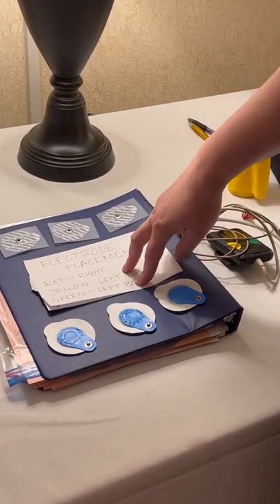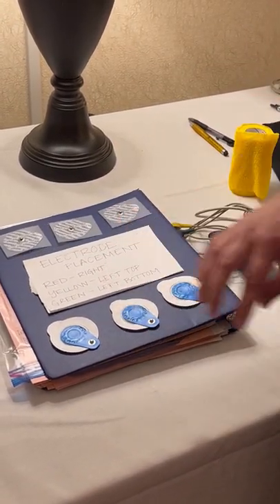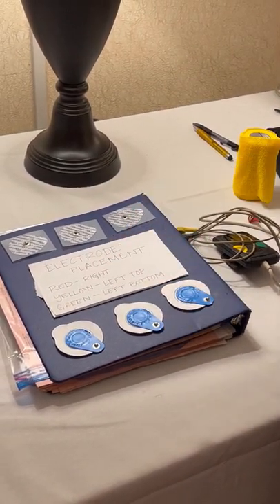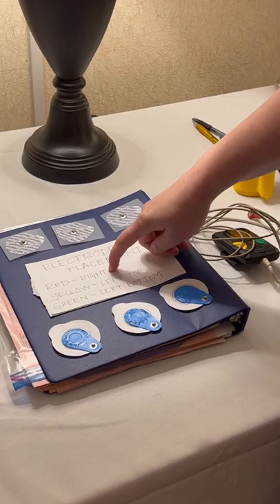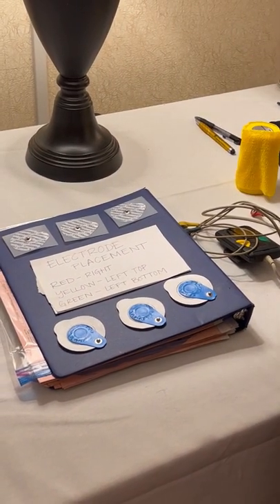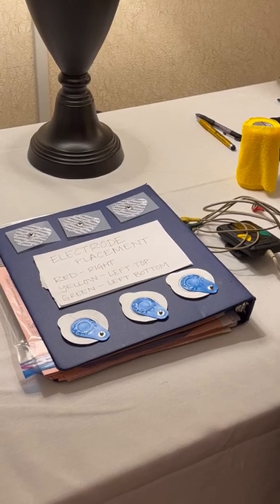The electrode placement will be covered again, but this is a European system, so the colors are a little bit different than what you might have seen. The red lead goes on the right side of the dog's chest, and then the yellow and green lead go on the left side. The yellow will go up towards the top, and the green lead will go on the bottom.